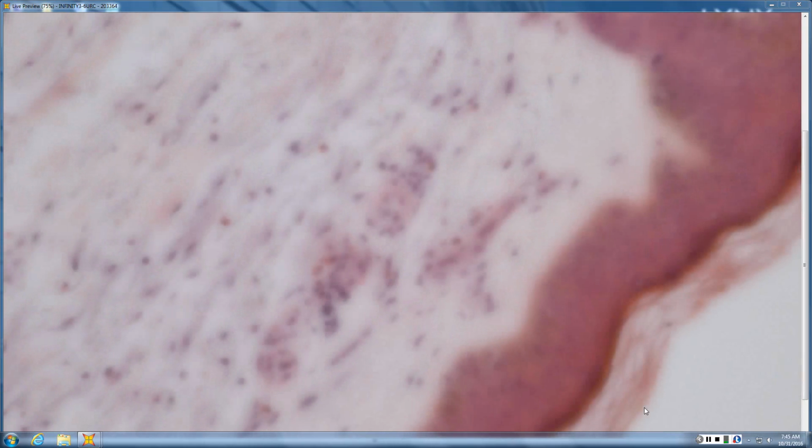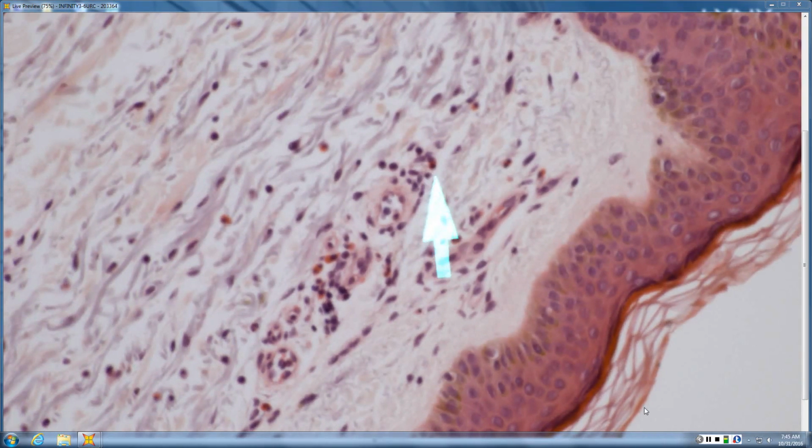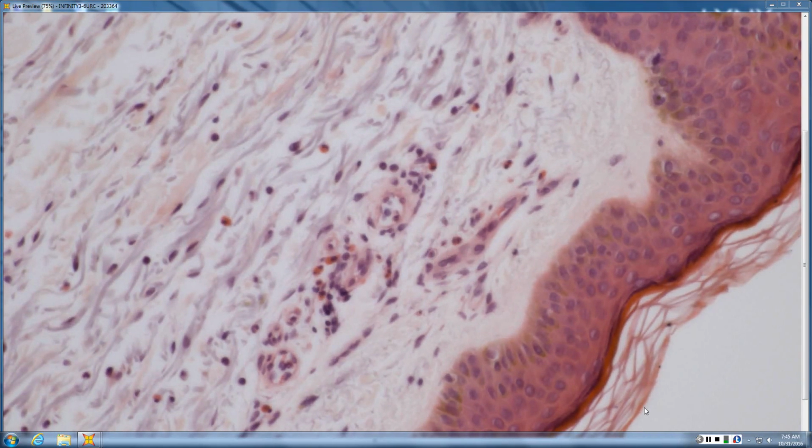Very common in urticaria, the eosinophils start to appear, but that's over time. So initially, it is neutrophils only. So vessels stuffed with neutrophils. That's acute urticaria. Vascular lumen packed with neutrophils. No karyorrhexis. Then they start working their way out from the vessels. Still no karyorrhexis. Then the eosinophils appear. Still no karyorrhexis.